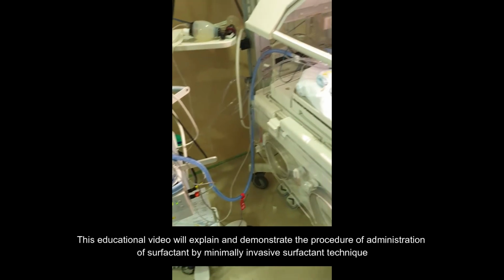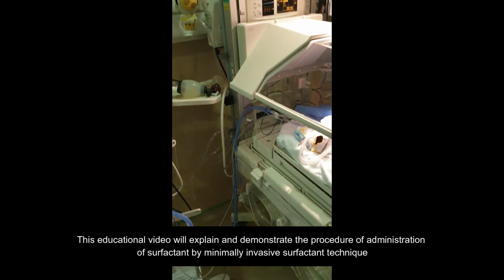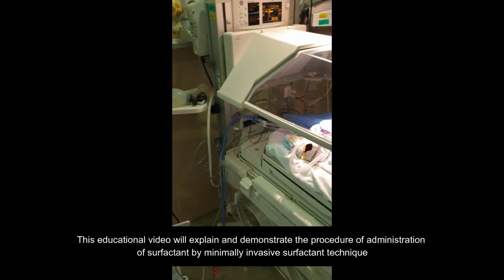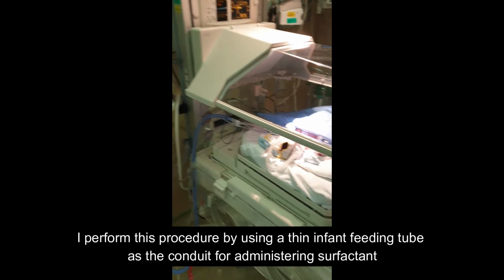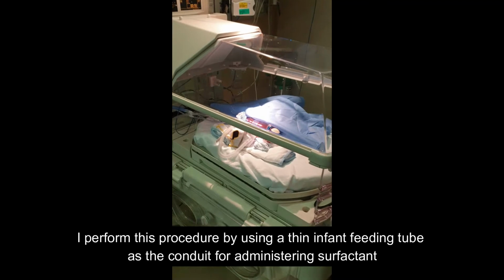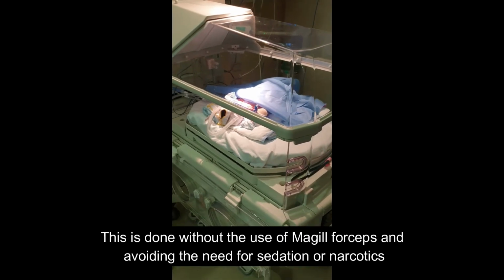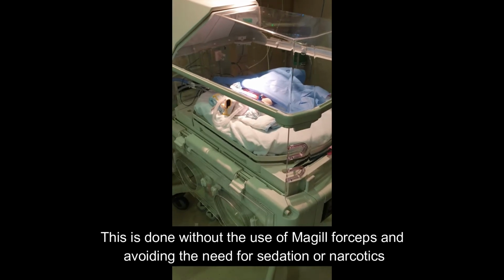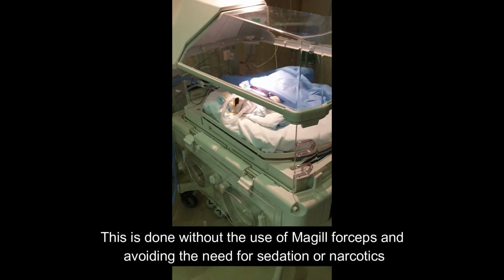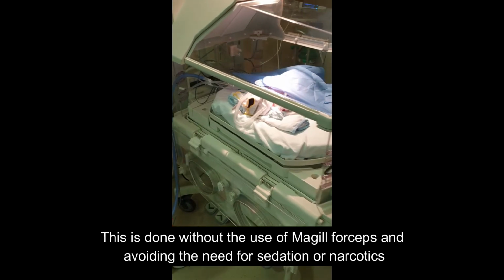This educational video will explain and demonstrate the procedure of administration of surfactant by minimally invasive surfactant technique. I perform this procedure by using a thin infant feeding tube as the conduit for administering surfactant in this particular baby. This is done without the use of Magill's forceps and avoiding the need for sedation or narcotics.